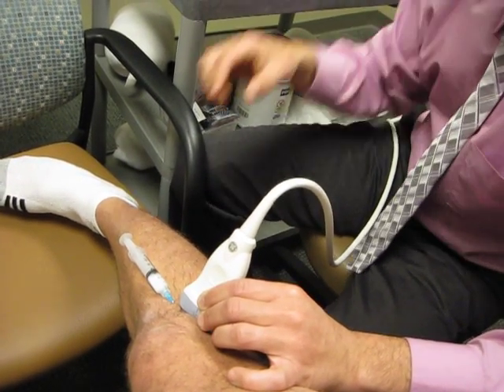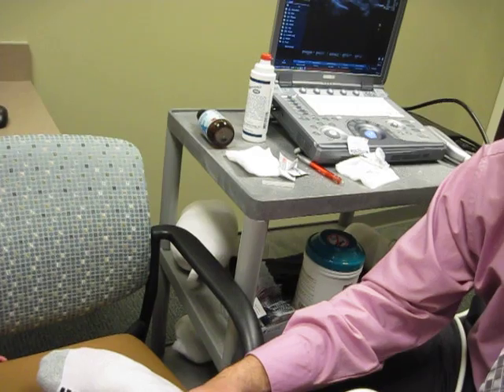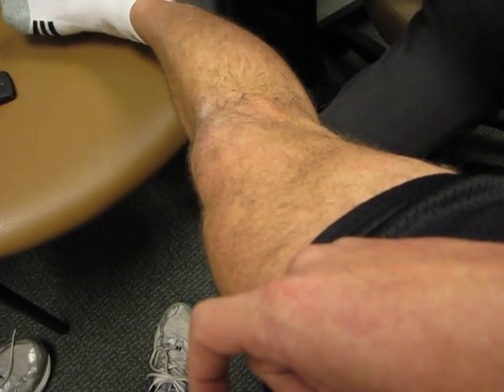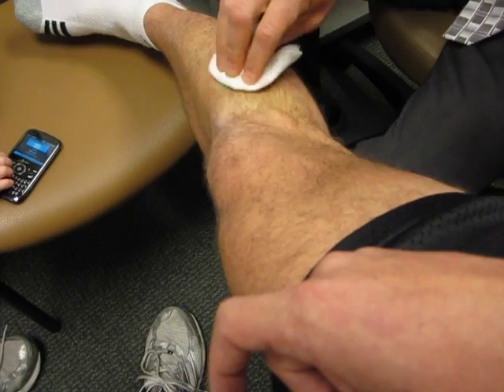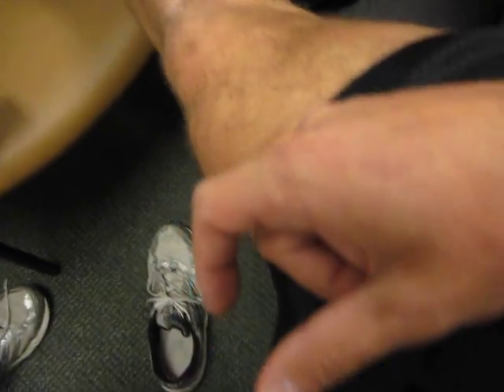If I look at your whole IT band when I push fluid — you see that? I'm going to pause for a second. We need to give it time to rest, because corticosteroid — tendons and things like that — I don't want you to... This is a band, it's not going to do anything bad. But I want you to give it at least 24 to 48 hours of rest. It's going to get worse before it gets better. Let me clean this area, then I'm going to check over here.